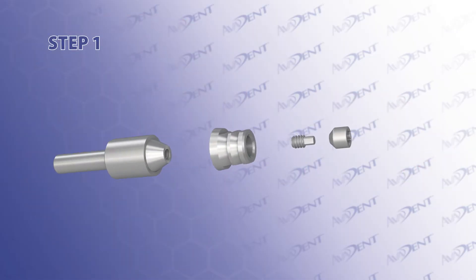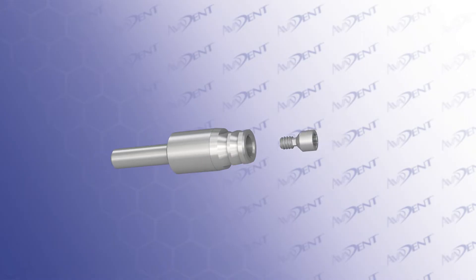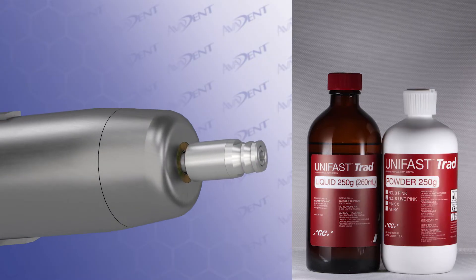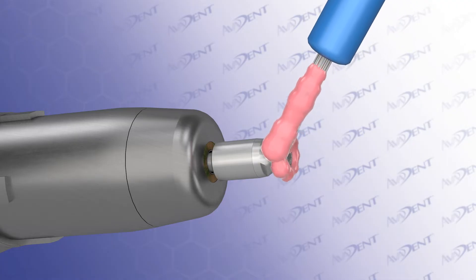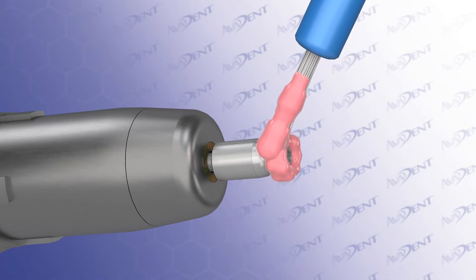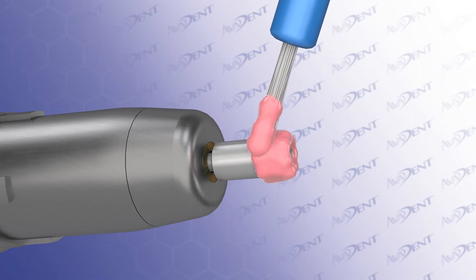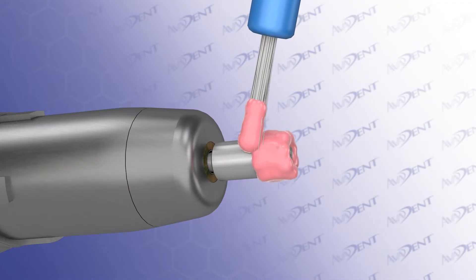Step 1. To ensure the successful pickup of the implant components into the denture, pre-coat the titanium bases or tie bases with your preferred pickup material. We recommend UniFast Trad by GC America. Using a coating mandrel on your lab handpiece, you can secure a tie base with a separable fastener and slowly turn the part while you add a thin, uniform layer of UniFast Trad to the tie base. Alternatively, this can be done by turning the mandrel by hand.